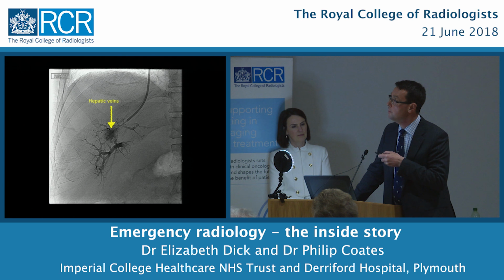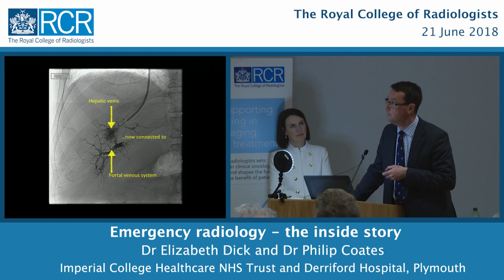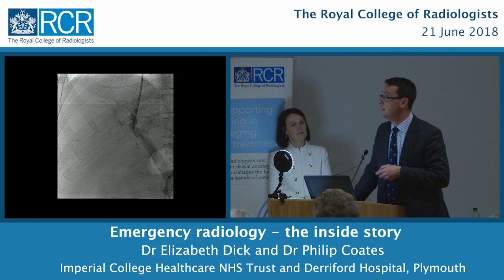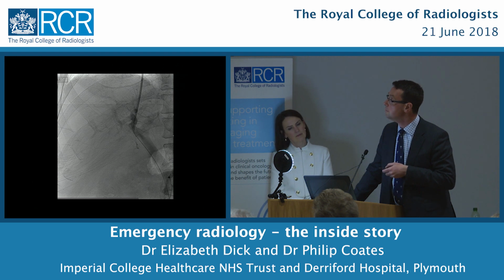So she's gone there from the systemic veins through the hepatic veins here into the portal vein, and that's what we're seeing start to outline with contrast delivered through a catheter here. So the two are now connected between the hepatic veins and the portal venous system in a connection which did not exist before. Having created that tract, she's going to have to balloon it up now to enlarge it. So a catheter with a balloon on the end will be expanded along that new tract in this area here. As the portal vein's been accessed.